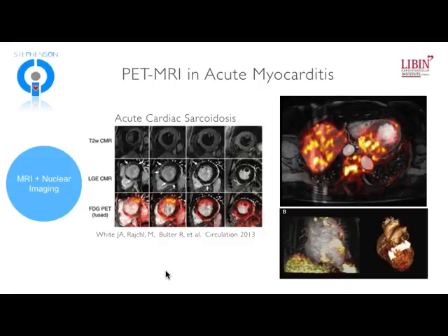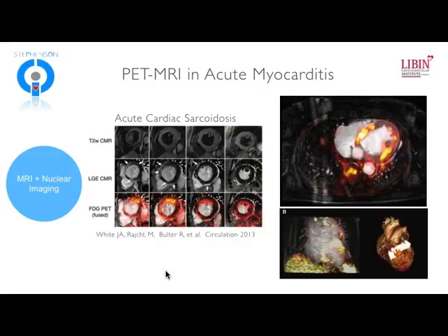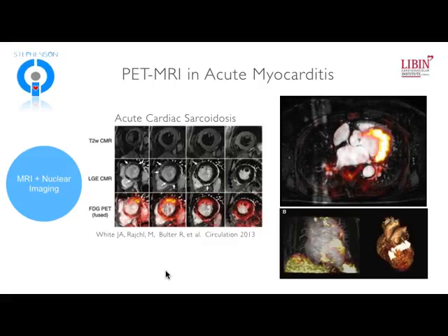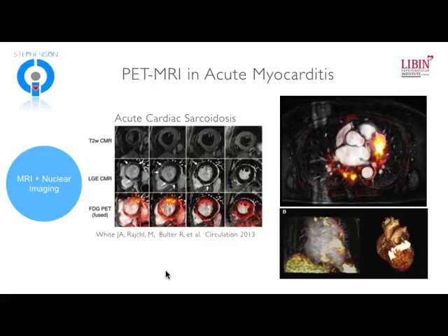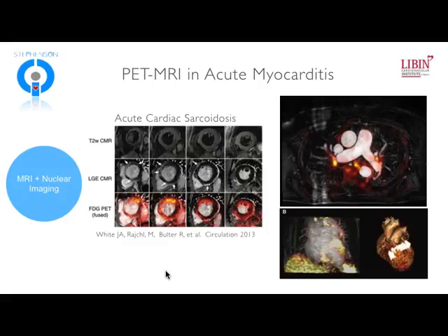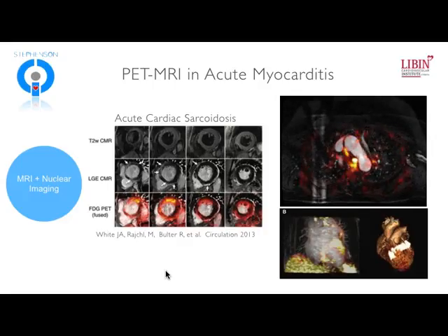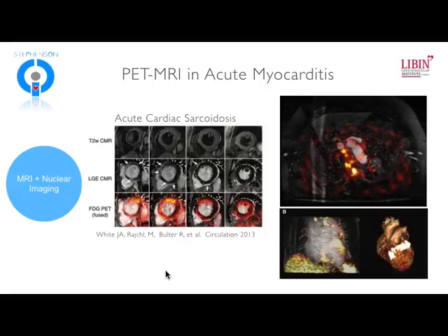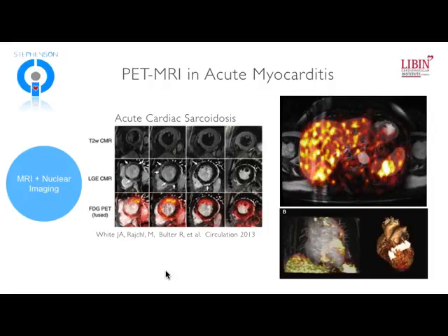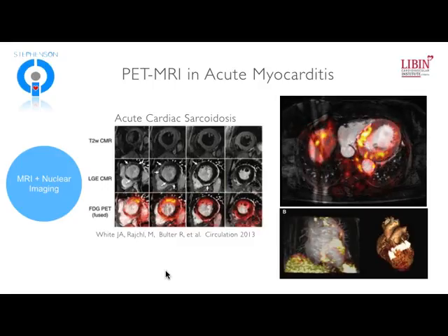If we put ourselves in a state of hibernation, essentially, we just don't eat for about 12 to 18 hours. So if we have a period of fasting, the myocardium will shift its metabolism from glucose into free fatty acids. And so it won't take up very much glucose at all. And so then what's left has to be a very highly metabolic tissue or cellular substrate to be able to take up FDG in that area, and that's what macrophages are. So macrophages are revved up and they love to gobble up some glucose.